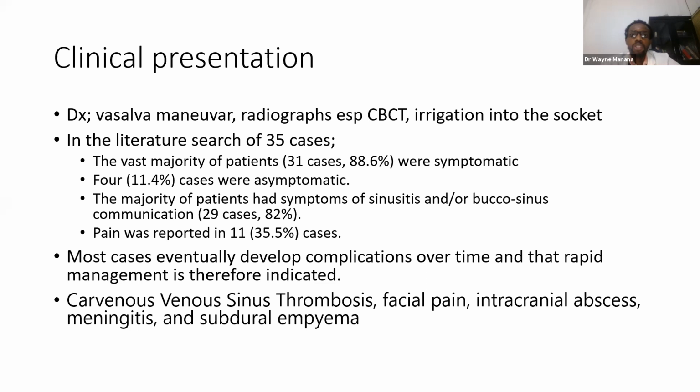But the better diagnosis can be done by a CBCT, cone beam CT, or if you irrigate into the socket, you see that there is a bubbling effect because of breathing. Now air is getting into the nose, into the sinus, and into the oral antral communication.